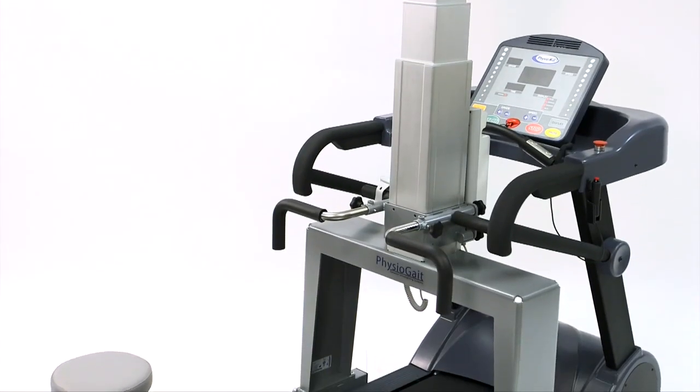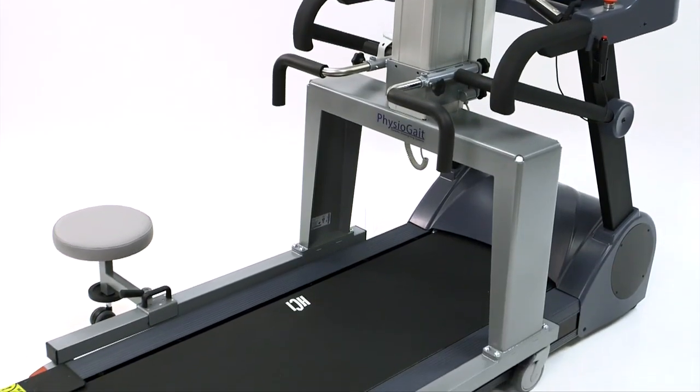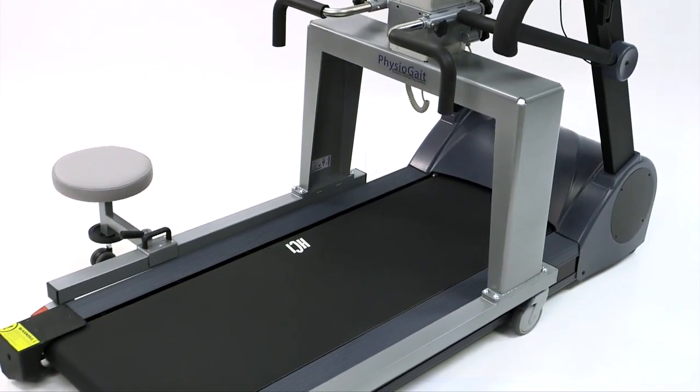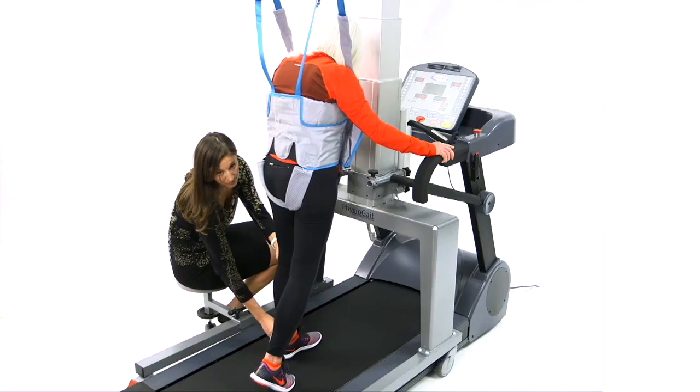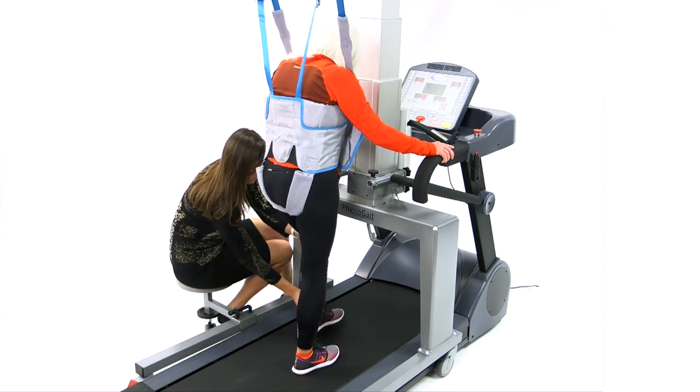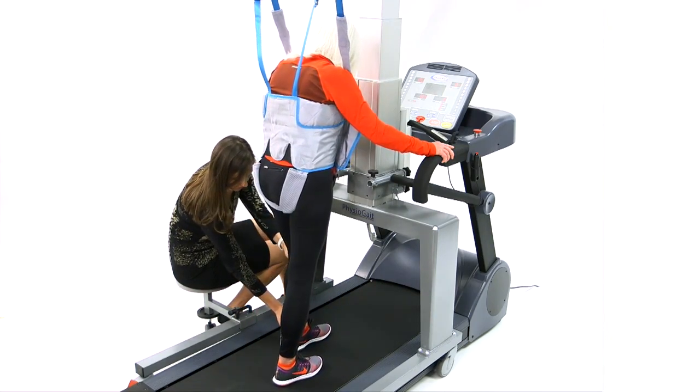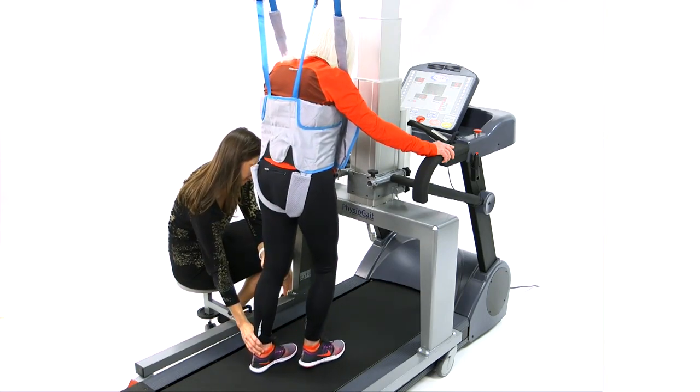The Physiogate can be purchased with a standard base or an XL base to accommodate a wide range of rehabilitation treadmills up to 34 inches wide. Combining the Physiogate Dynamic Unweighting System with the Physiomill or other treadmills allows for over-treadmill bodyweight-supported therapy.